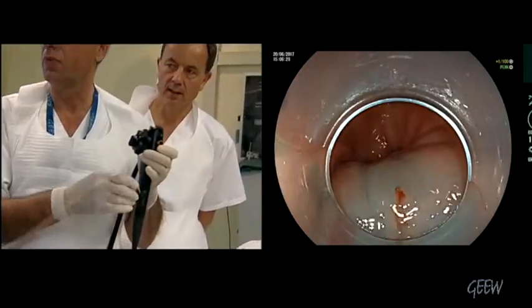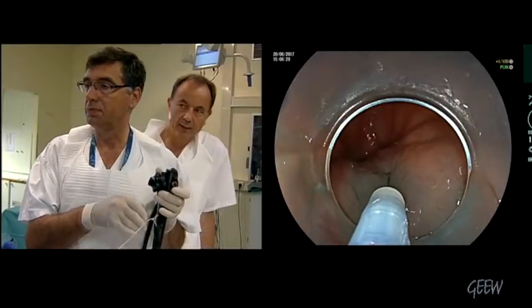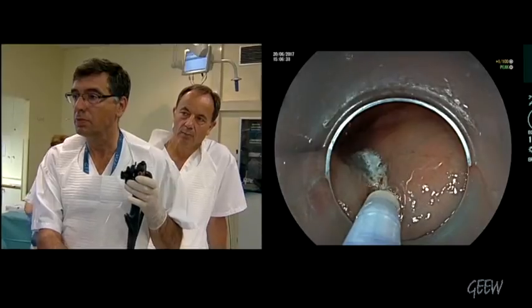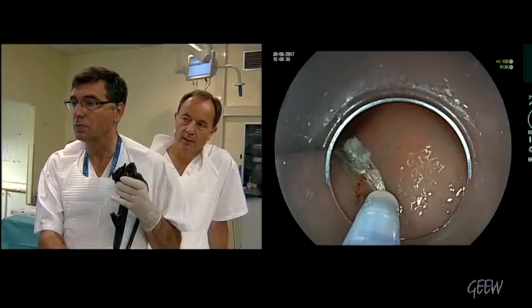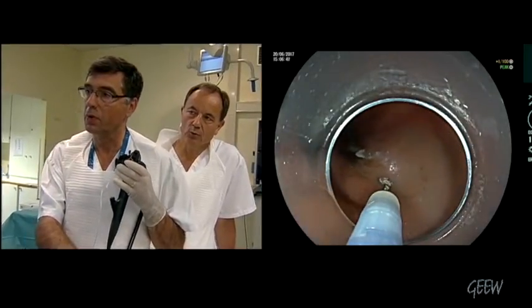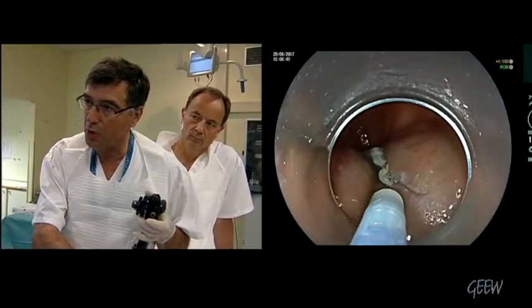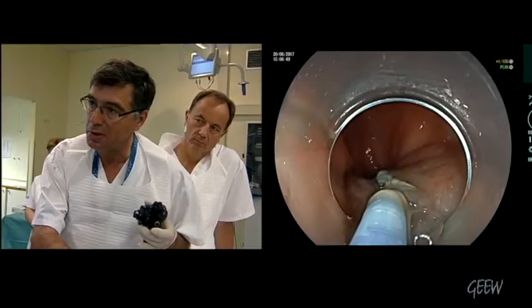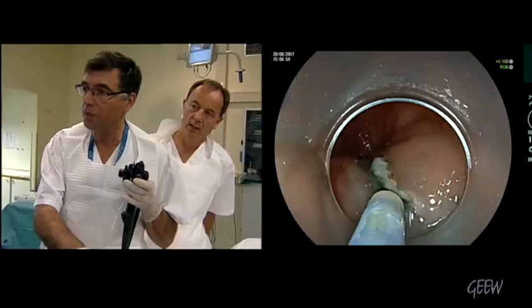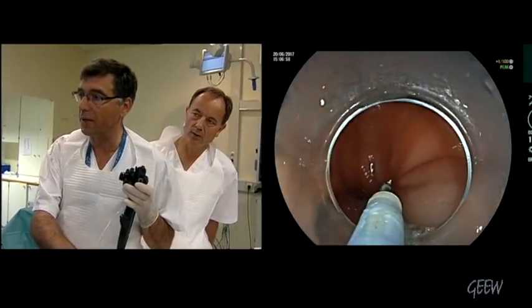It's very important to have an appropriate space between the mucosa and the muscle layer. Mark, pull with the triangle knife. The alternative is to push it forward, but as the patient had surgery, when I push it's not so simple to get a good action. As long as you have this nice cushion, the risk of approaching the muscle layer is extremely low. You have to take care of it.